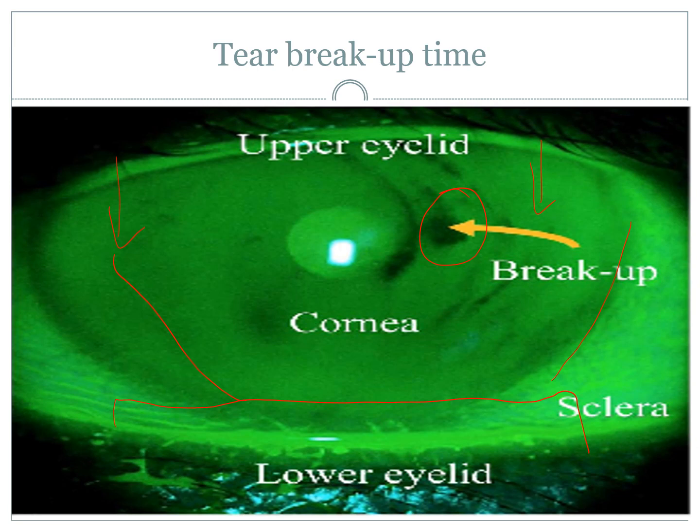If a patient blinks before the 10 seconds is up, then the test has to be restarted. It's best to take two measurements. Basically, if any black spots occur in less than 10 seconds, then you have an indication of dry eyes, and that could be your diagnosis. This patient has dry eyes, and you can give them medication to help lubricate and protect their eyes.